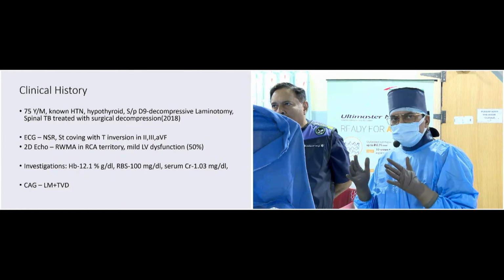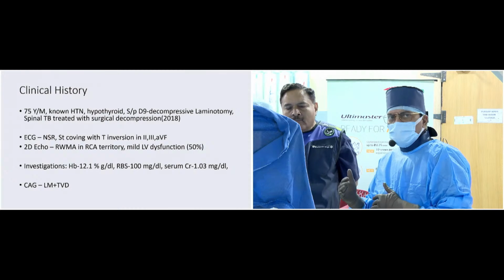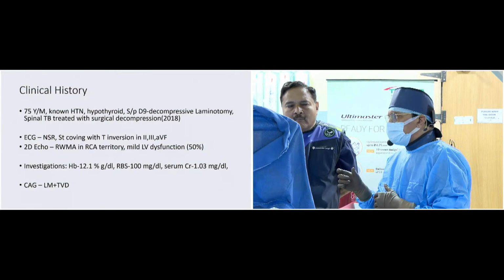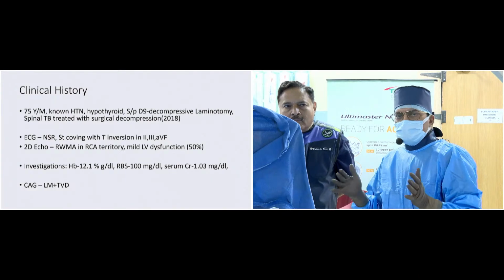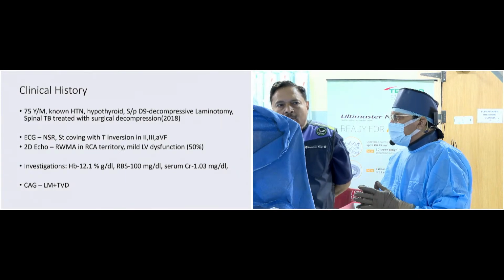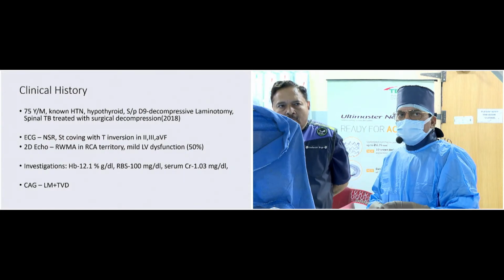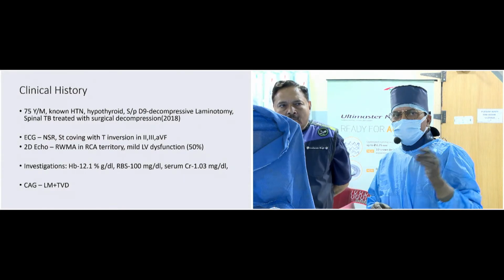Whether you see the large, middle or smaller size, the strut thickness is the same, only the crowns change. When the crowns are more, it expands nicely, symmetry is well maintained, and geometry is maintained. That is the reason vessel conformability is very good with this stent.